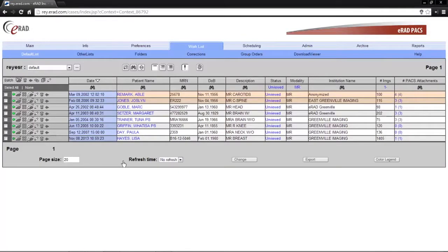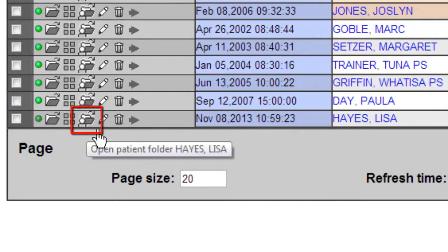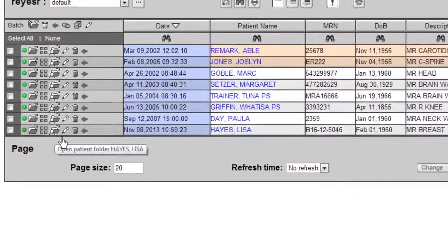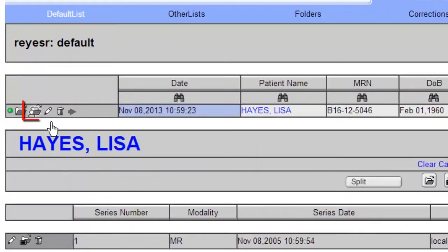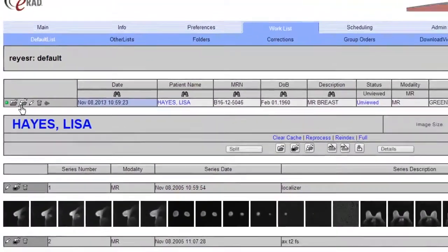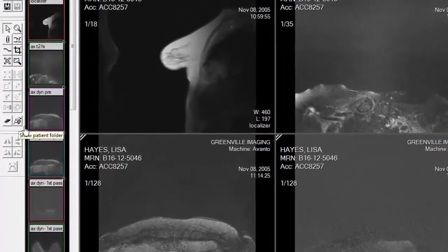Let's start with a new feature: the patient folder. You may notice a new icon in the study control area of the work list. This is one of three places where you can access the patient folder. You will also find the patient folder icon in the quick view page and also in the diagnostic viewer.